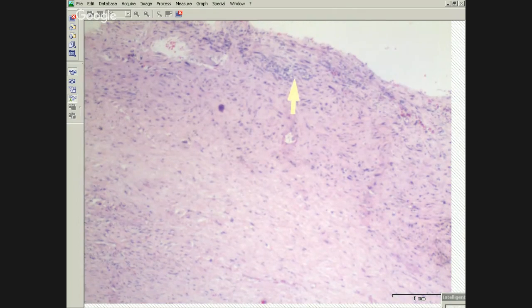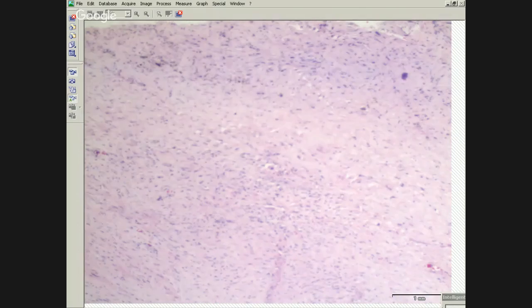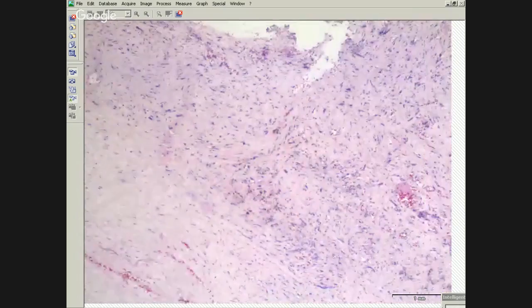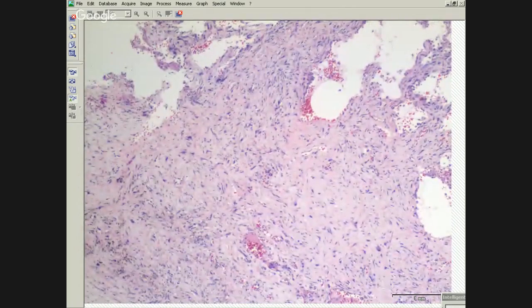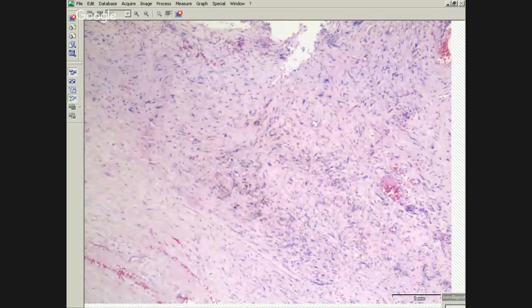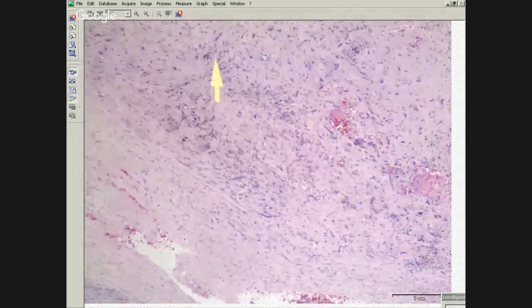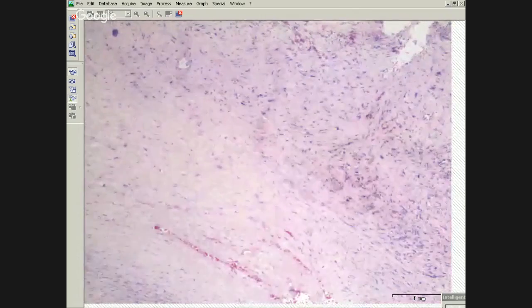And this, I think, is one of the hardest diagnoses really in the whole of pulmonary pathology because it can be so subtle. So what you want to see with this is storiform morphology. You want to see it invading things like we're seeing it invading the lung here. If you see bland necrosis, that's helpful. And then one of the other criteria is distant metastases. So obviously if you got that, you know it's malignant. And then if it has other, frankly, sarcomatoid areas mixed in with it, then you know that this is a malignant area here. But honestly, if you've got this area, you're not quite as concerned about what's going on over there, but this can be very tricky.